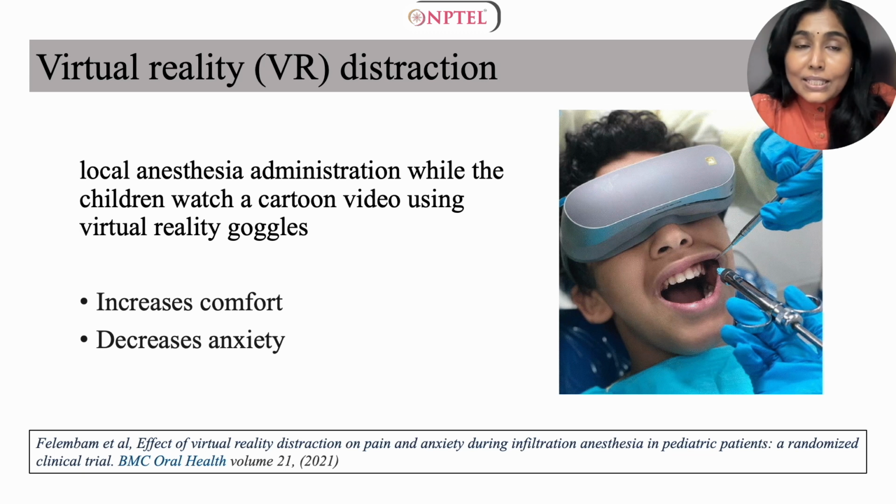Audiovisual distraction techniques are used in dental clinics and have shown great results in managing anxious pediatric patients. Virtual reality distraction, defined as a human computer interface that enables the user to interact dynamically with the computer generated environment, is a new method in the medical field.